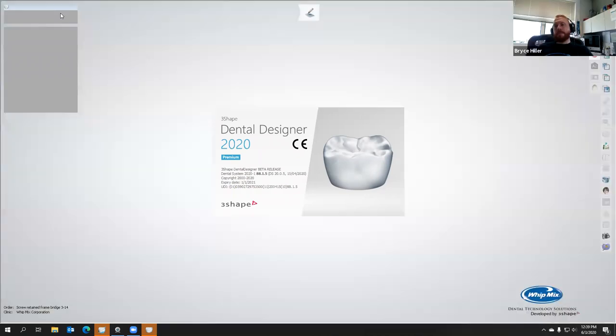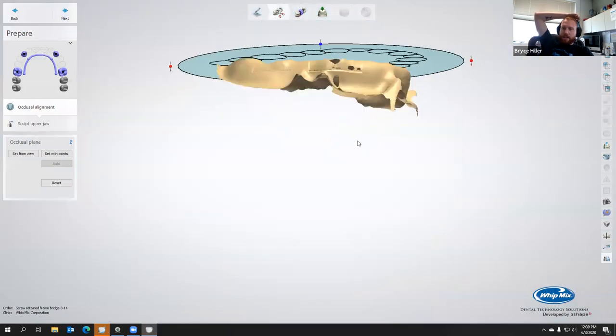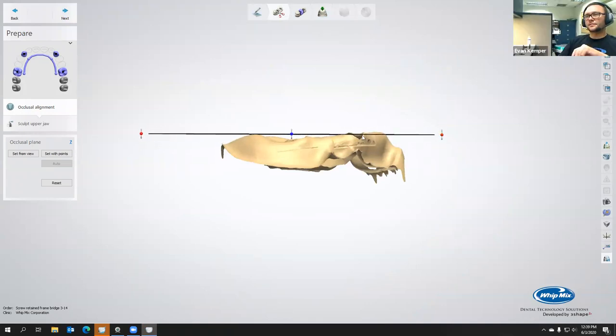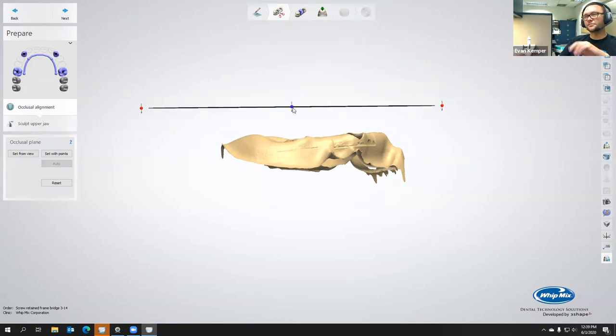So let's say you're not doing this in an instructional setting. Realistically, how long on average would it take you to scan that in? 5 minutes maybe? Oh yeah, probably less than that. I'd say 5 minutes on the old scanners, not even the E-series, but the older D700, 800, 900 ones. The multi-line scanners are just way faster than those.